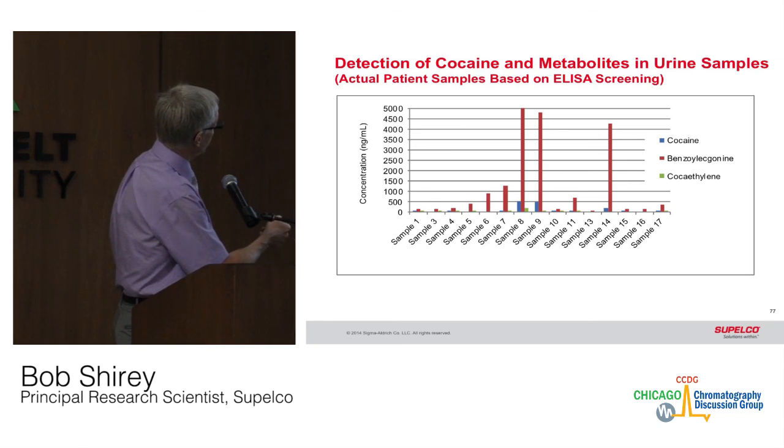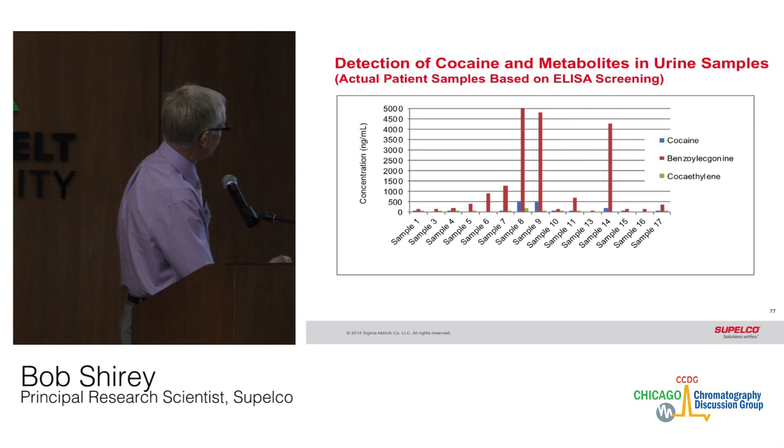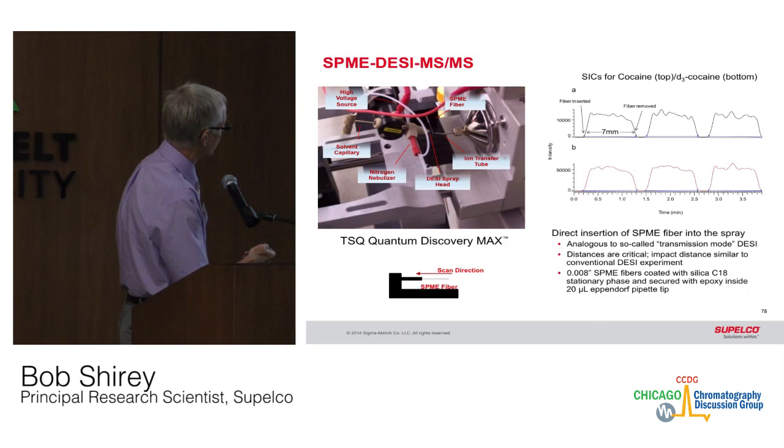Now, as I said, these samples were previously screened by ELISA. You can see some are post-mortem by the high concentration of the drugs present, but you can see that the fiber was very good at extracting over a wide concentration range for all these drugs.